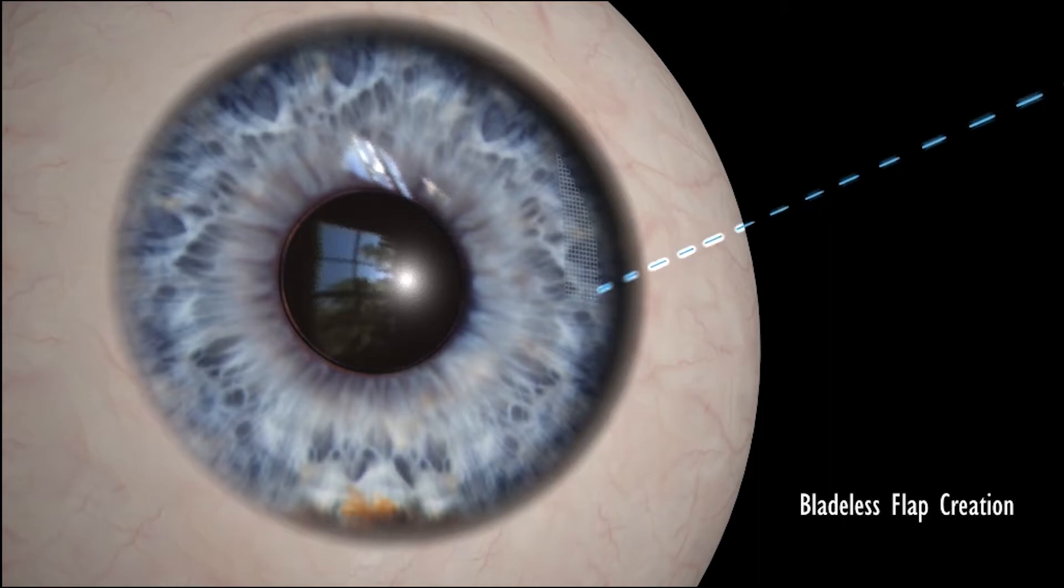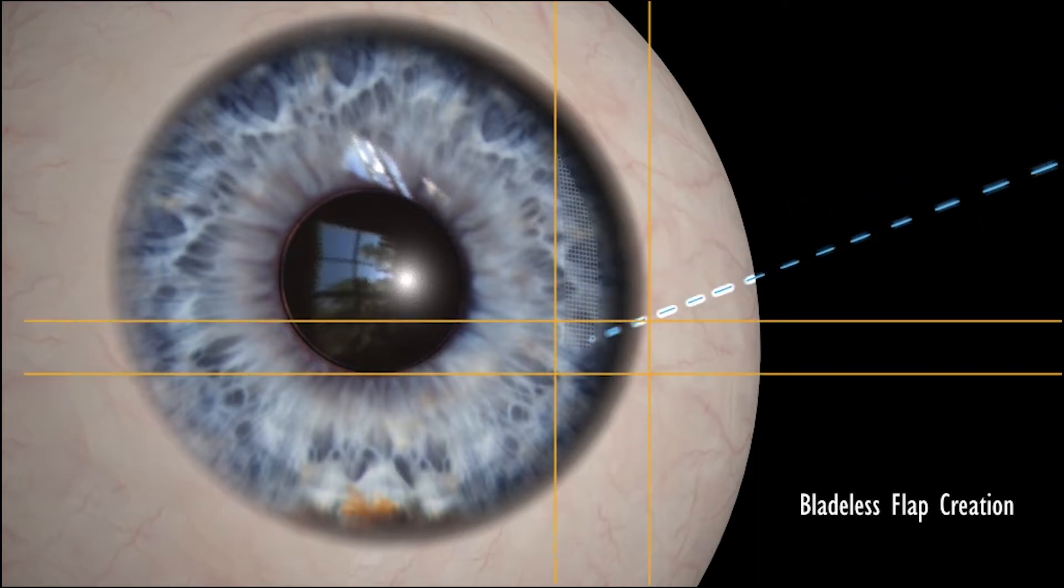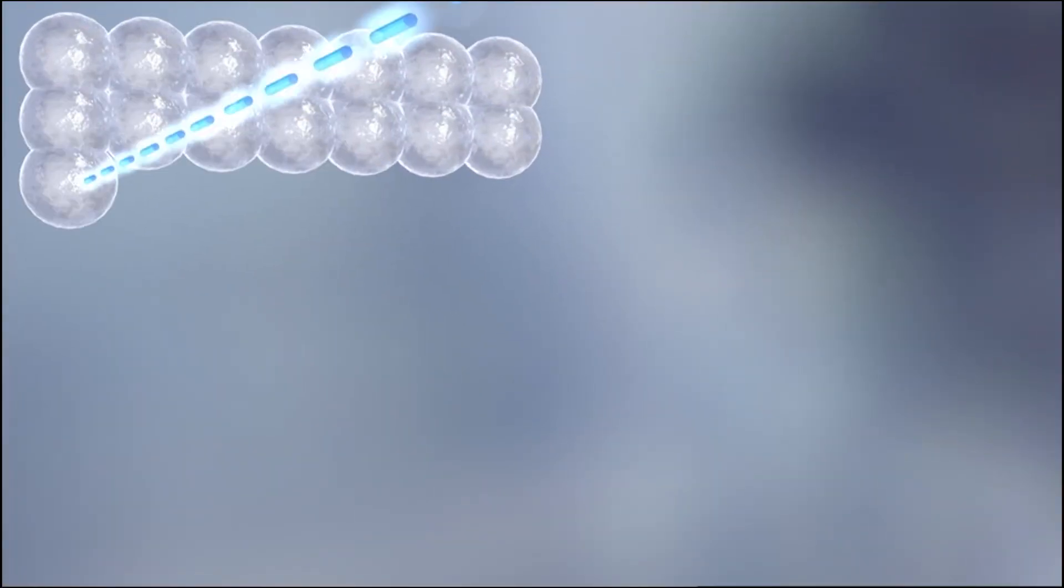Z LASIK is a two-step, bladeless procedure. With a femtolaser, your surgeon creates a thin flap on your cornea.